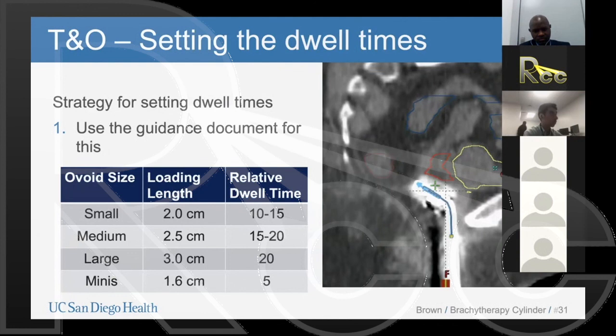Great. And then a question from Deepak, the importance of point B, that is a great question. And I know we do talk sometimes about point B. I have not included it here because we pay absolutely no attention to it. What it's representing is the dose to the nodal volumes on the right and left sides of the pelvis. And there are historical reasons for why we would care about point B in the past, but with our ability now to generate 3D external beam plans and then boost those plans with also image-based HDR, we're less concerned about that during the HDR portion of the treatment delivery. We actually don't consider that at all in our clinical evaluation of brachytherapy plans. That's a great point. Thanks so much, Derek.